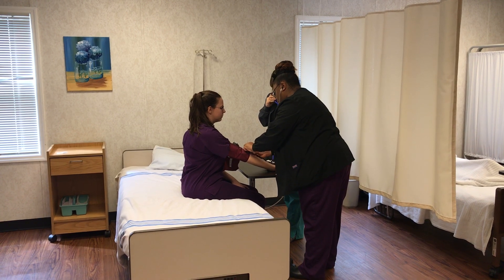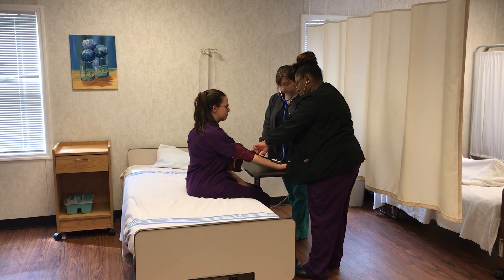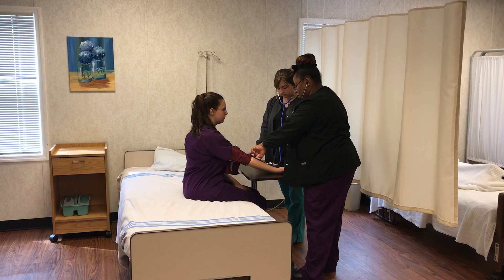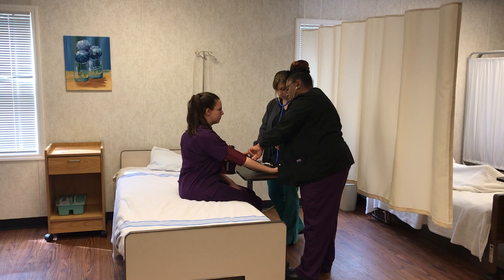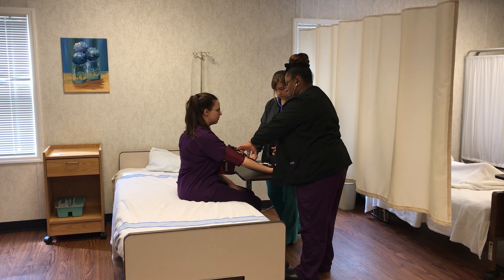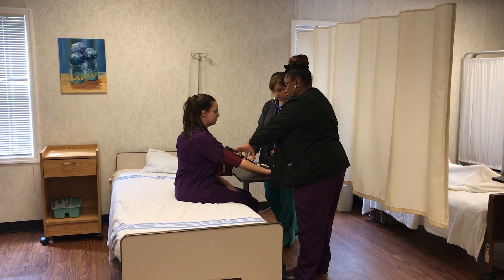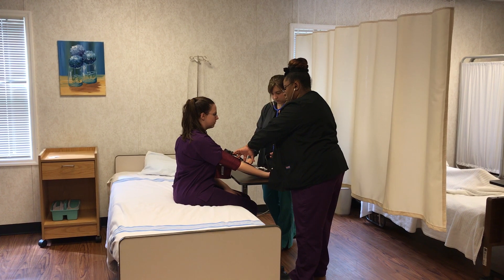Placing the diaphragm over the artery mark, you'll inflate the cuff from 160 to 180, then release, making sure to take note of the systolic and the diastolic number.